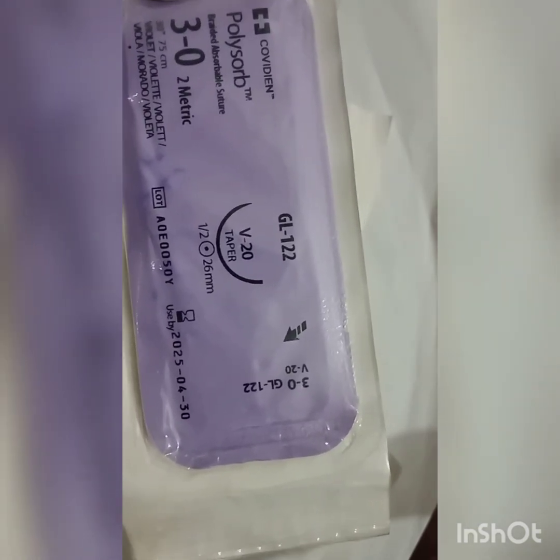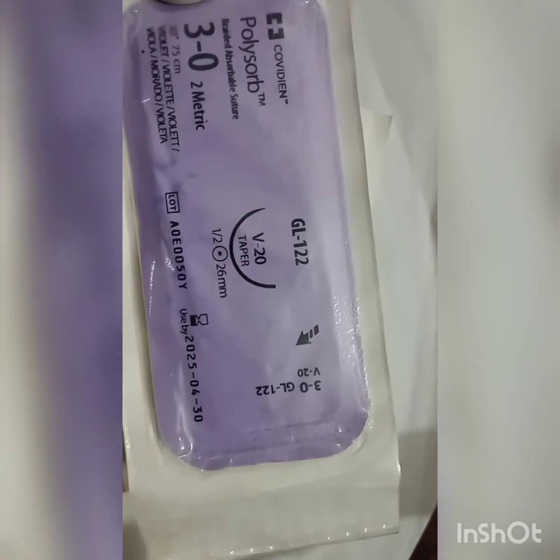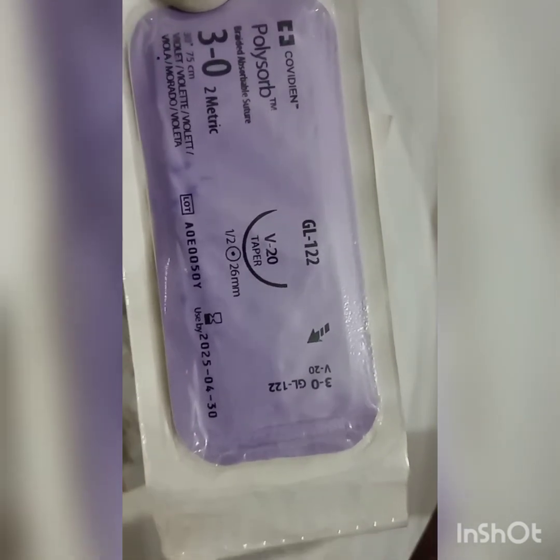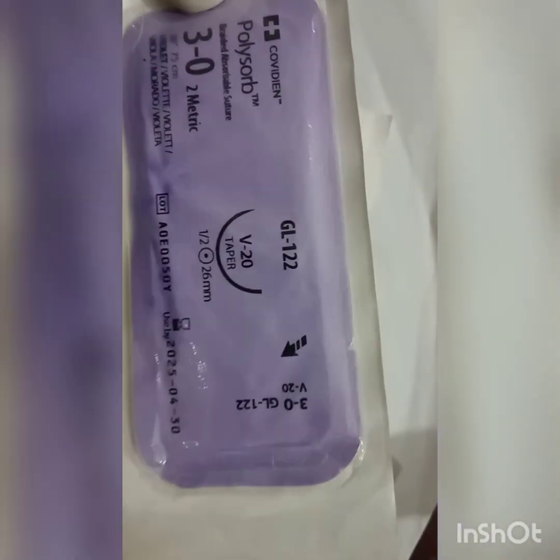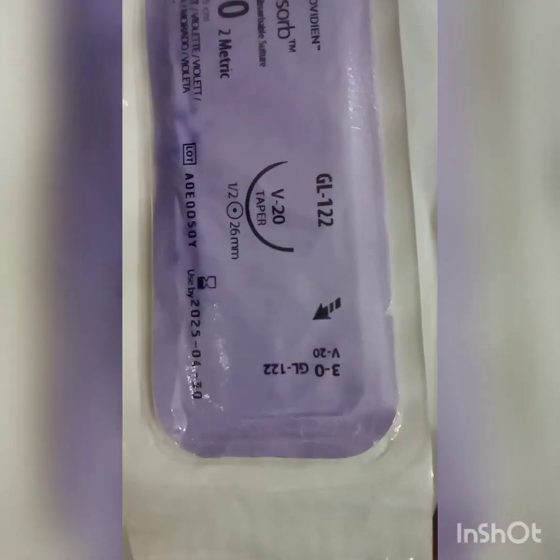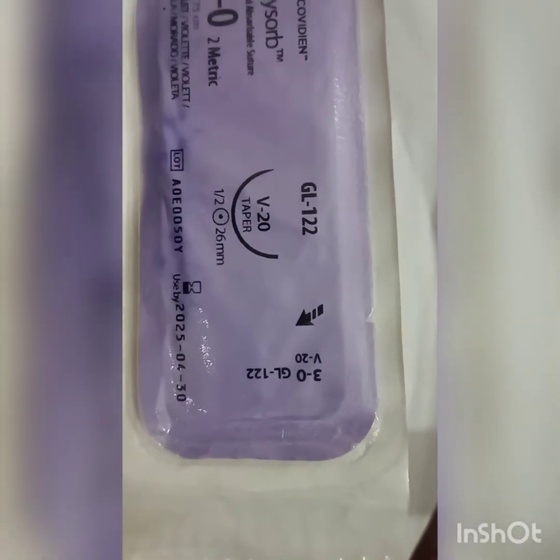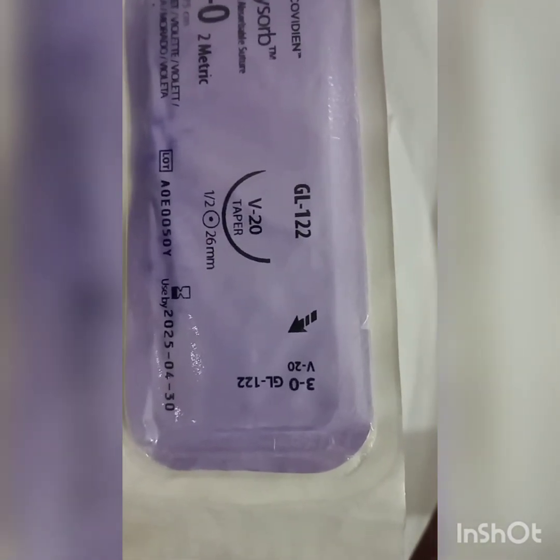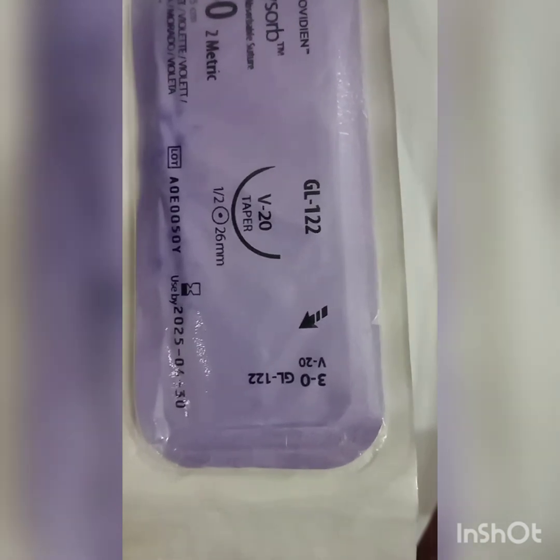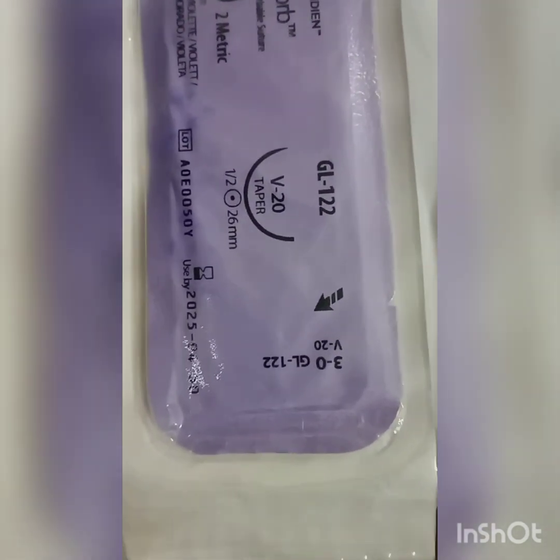You will find a conversion chart from USP to metric to millimeters on the internet. I will not go into further detail, but for this one, suppose 3-0 is equal to metric 2, and if you see the chart, as this is a synthetic suture, it would be equal to 0.2 millimeter. But if it had been catgut, it may be equal to 0.3 millimeter in the metric system.